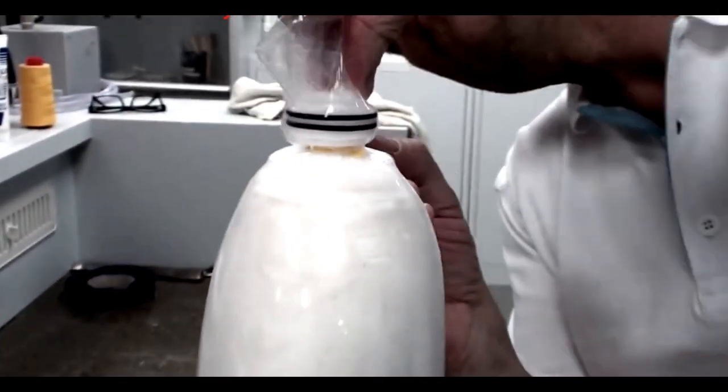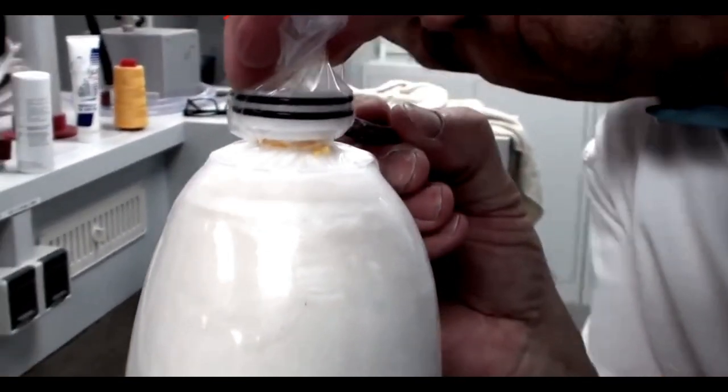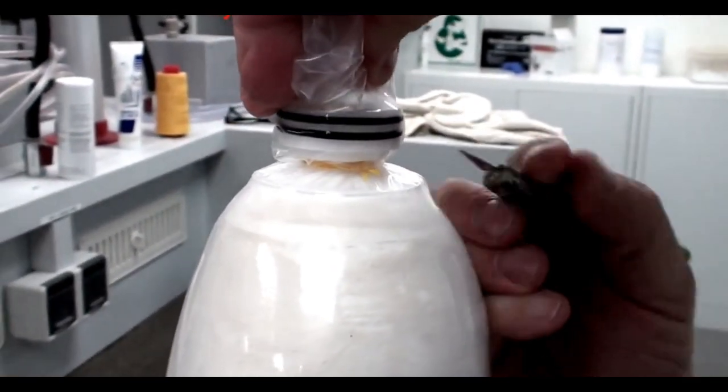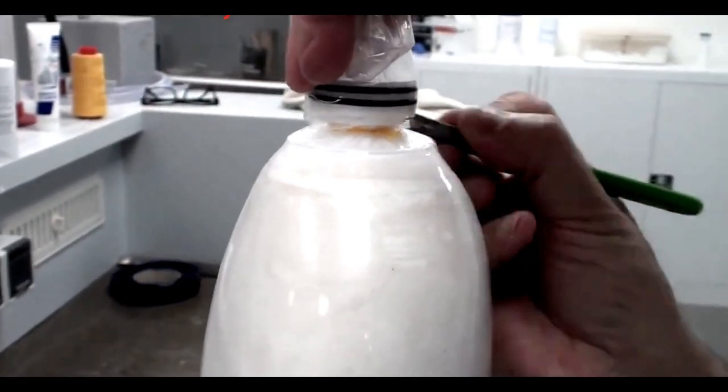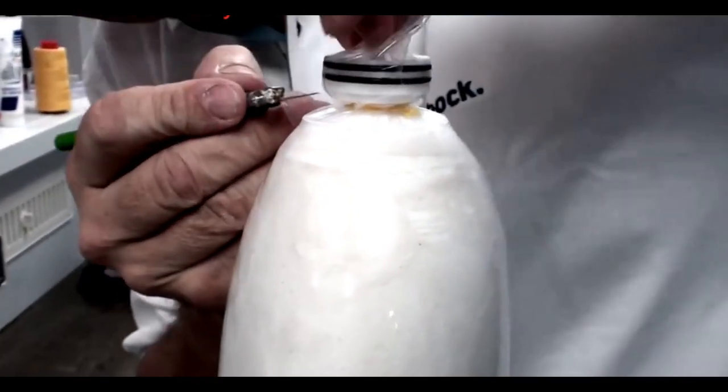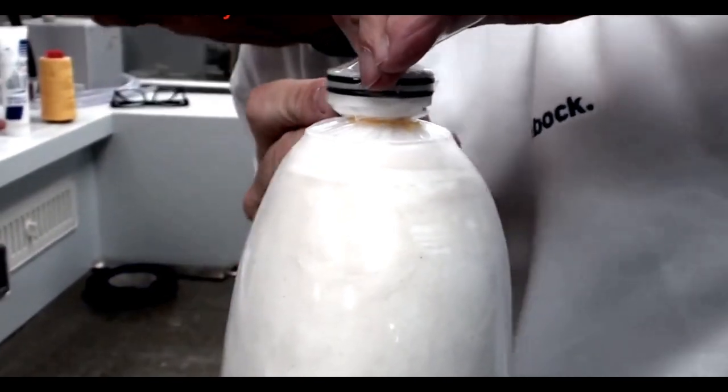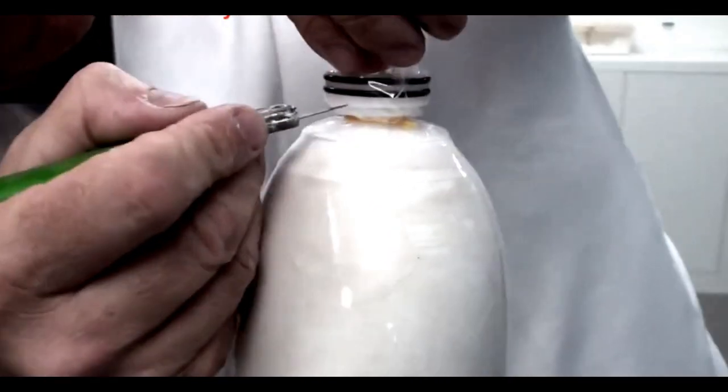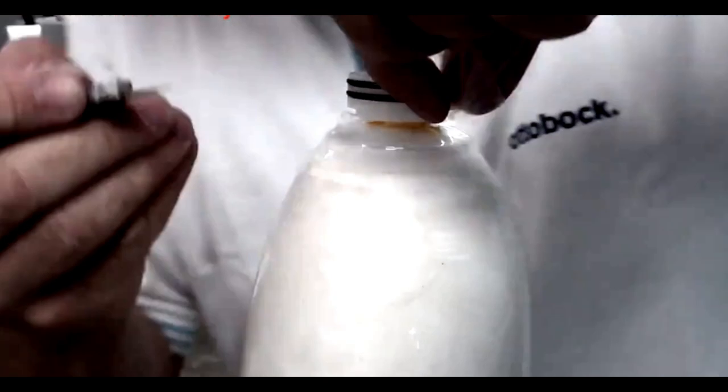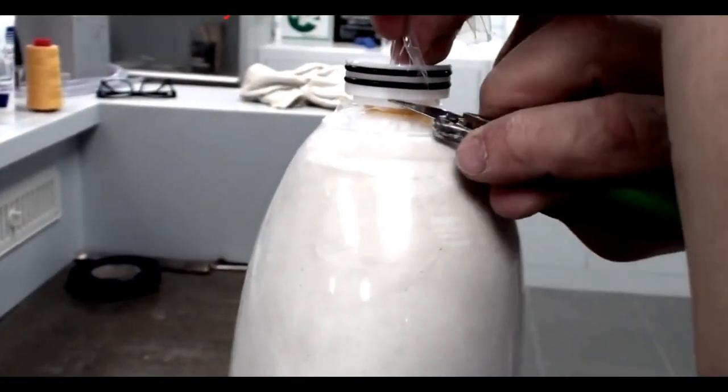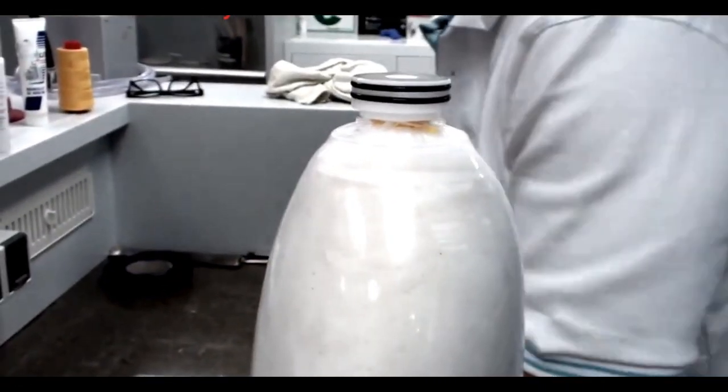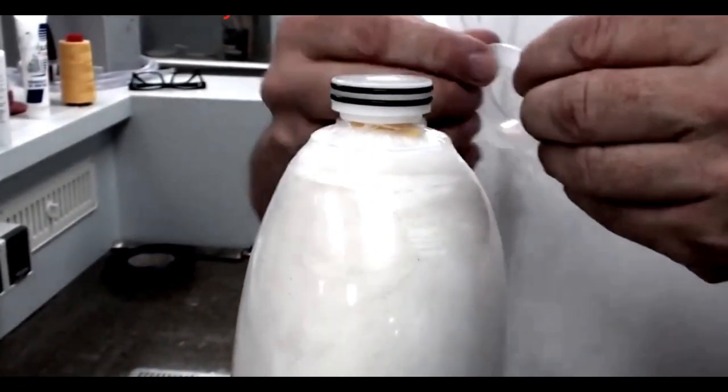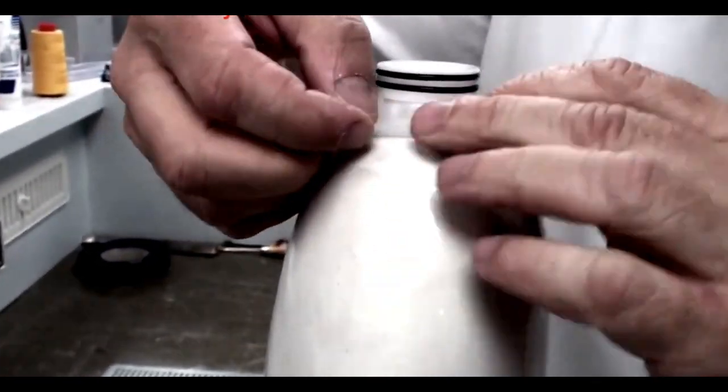Use the scalpel to cut away any excess PVA bag. Just above the level of the thread, place a silicone ring over the lamination dummy.